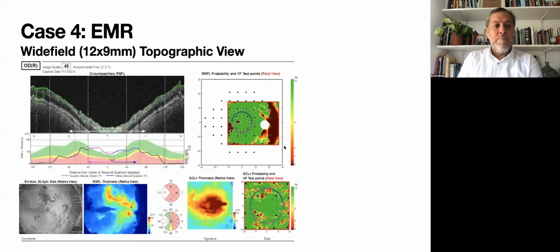We will go there. But not everything is glaucoma. So sometimes we have OCT scans that look like this. If we just start looking at the numbers, at the metrics, and at the colors, we'll see everything is on red here, and there is a defect here from the optic disc. Oh, that could be glaucoma.